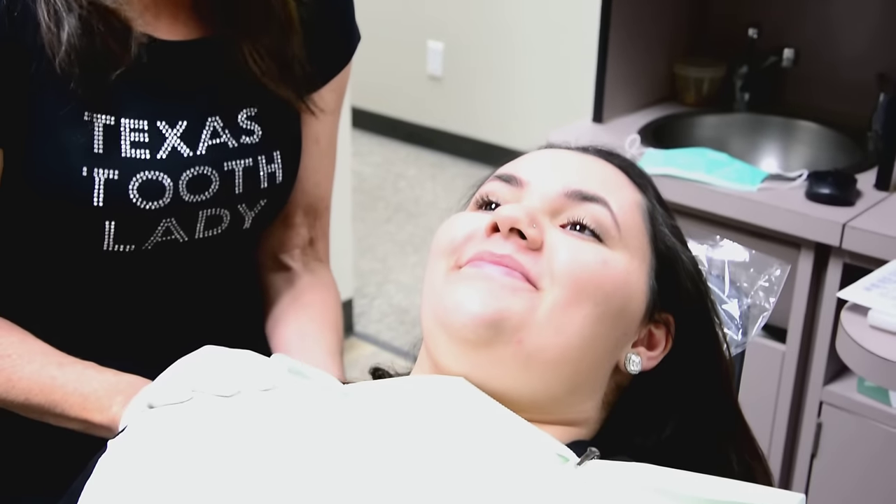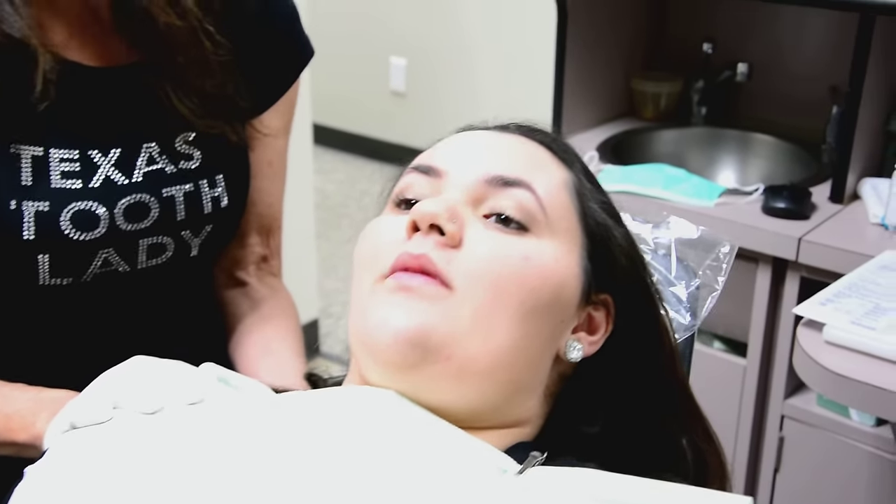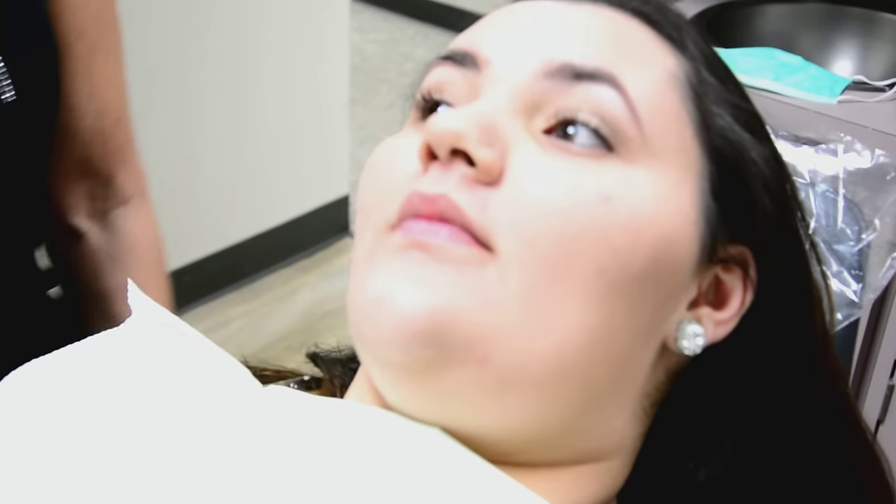I'm going to give you an idea of exactly the procedure for the snap-on smile. Here we have our patient, and let's go ahead and get a close-up and see exactly why we're doing the snap-on. Mercedes, you want to go ahead and talk about why you've chosen to do the snap-on smile?